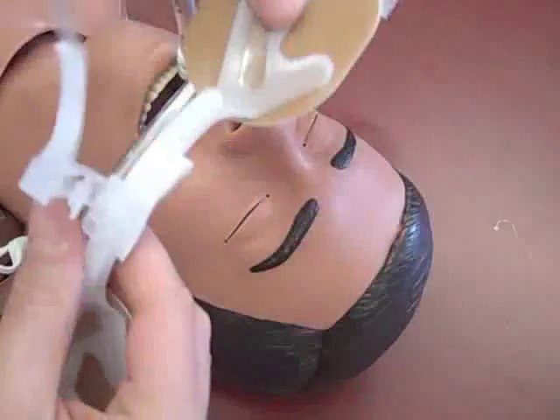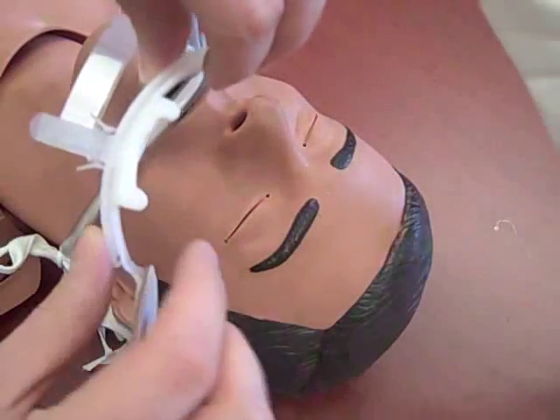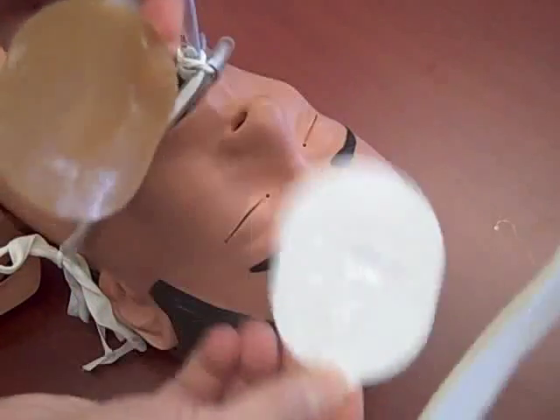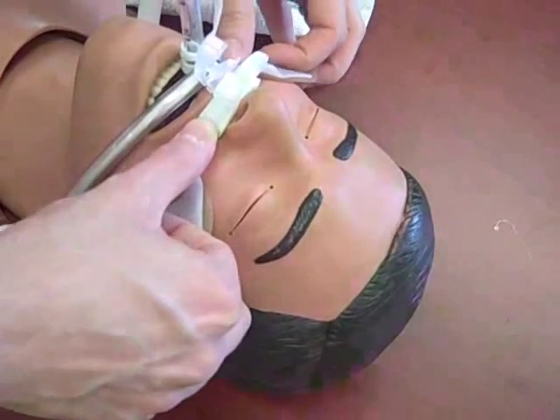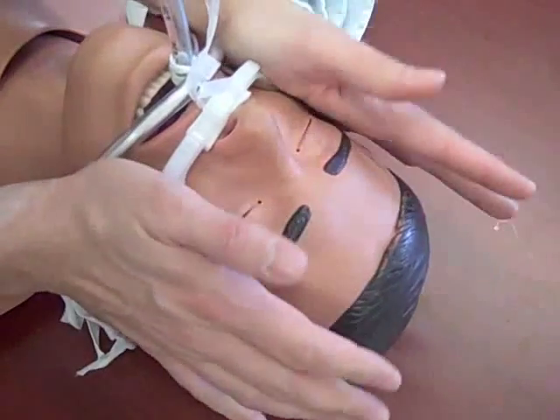The adhesive strap should be positioned on the side of the endotracheal tube. The foam pads rest on the upper lip. Remove the adhesive liner, then place the foam pad on the upper lip. Position the cheek pads and press down. Hold the device in place for 30 seconds, as the adhesive is heat activated.